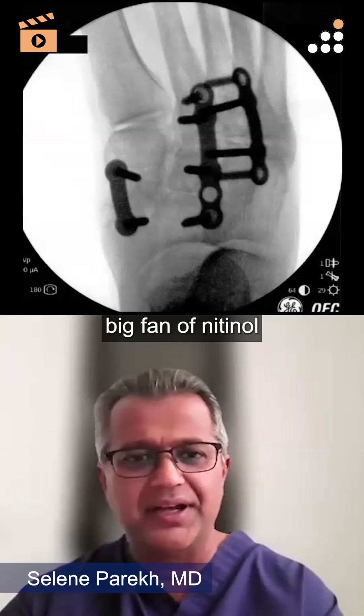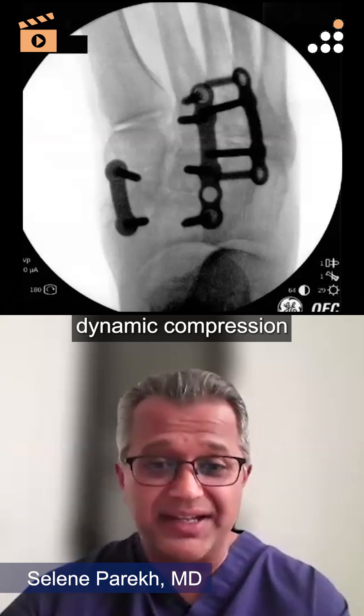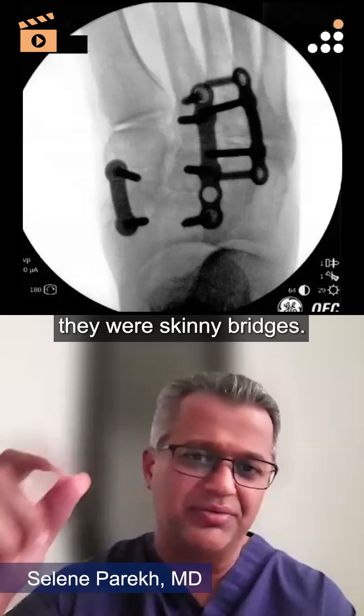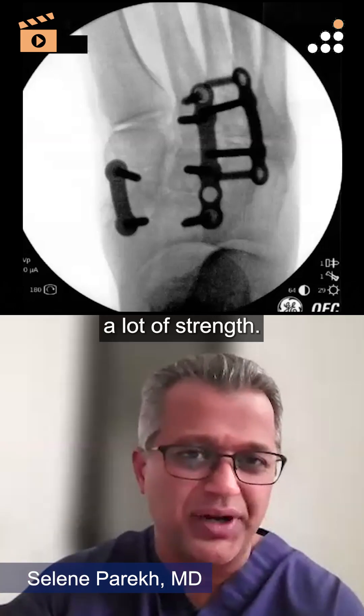I became a big fan of nitinol very early on because I think that dynamic compression really does make a difference. When those staples first came out, they were the skinny bridges and so you got a lot of dynamic compression, but you didn't have a lot of strength.